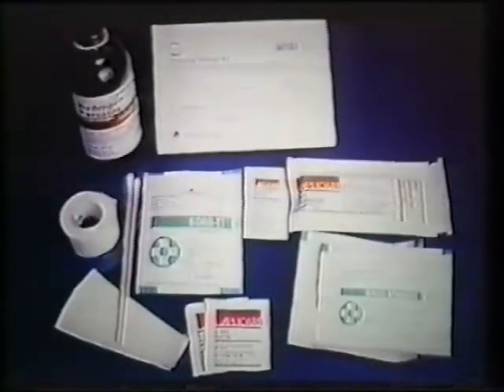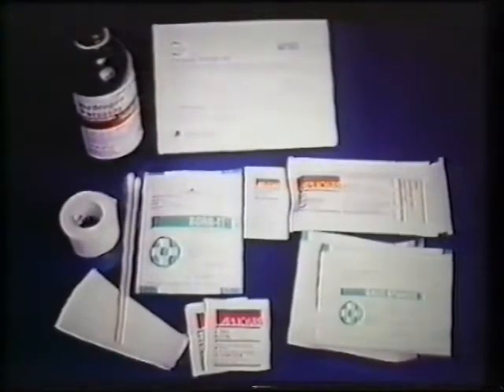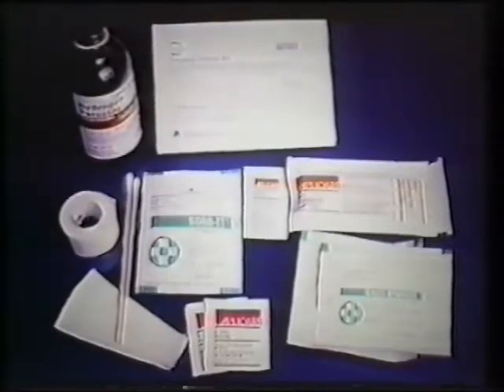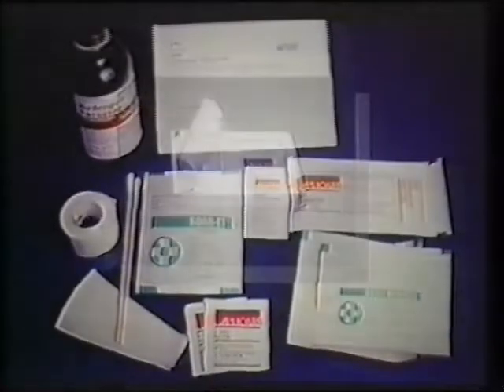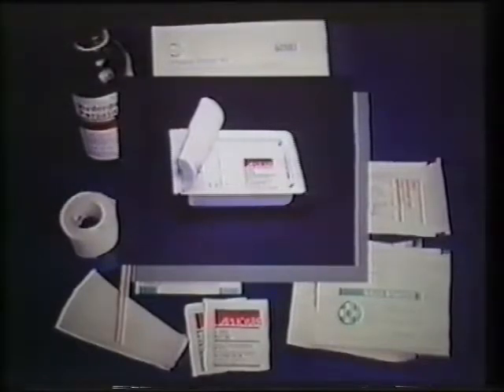Let's look at dressing the catheter. Catheter dressing changes are part of the catheter's daily care, because both the primary incision and the cutaneous exit site are potential areas for infection. You should clean and dress the incision site daily until it heals. To change the catheter dressing, assemble the following materials: 3% hydrogen peroxide, sterile cotton tip swabs, povidone iodine swabs, povidone ointment, sterile 2x2 gauze pads, sterile 2x2 IV sponges (optional), 1-inch paper tape, and alcohol wipes. Sterile dressing change kits containing these components are available from Dayvol.